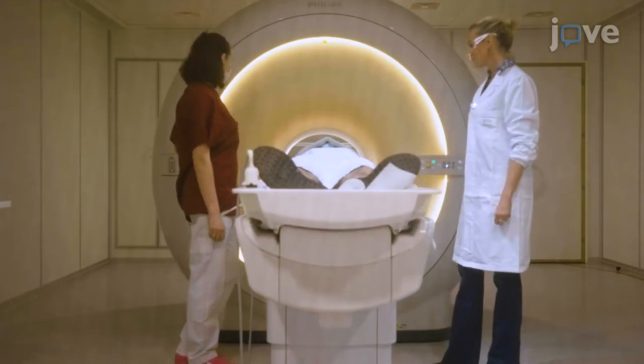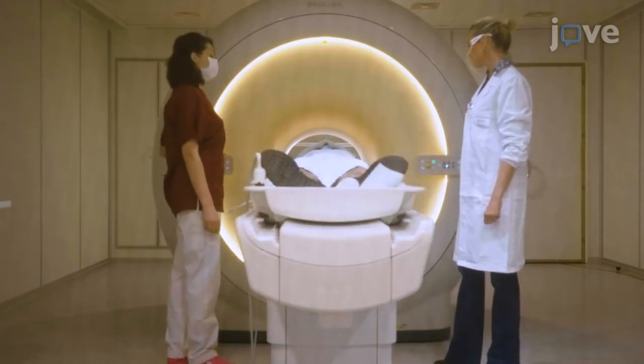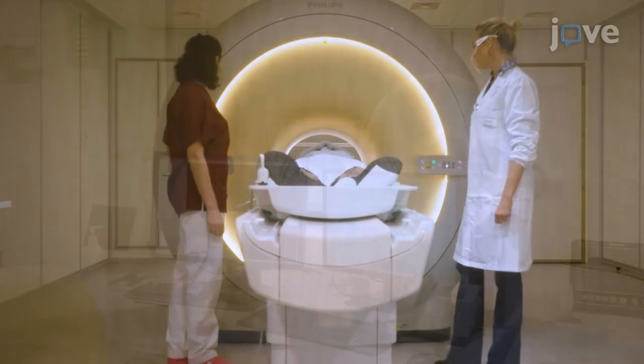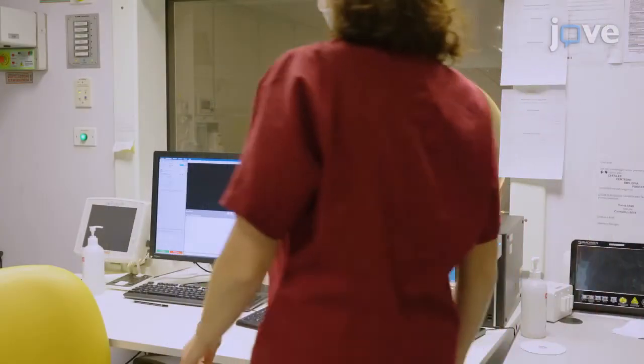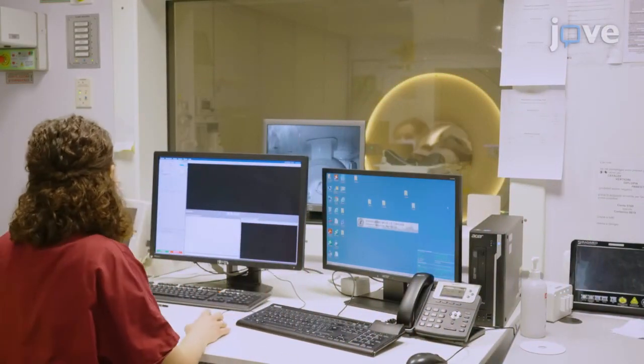Instruct the subject to remain still. Then run an MRI session from the workstation in the control room.